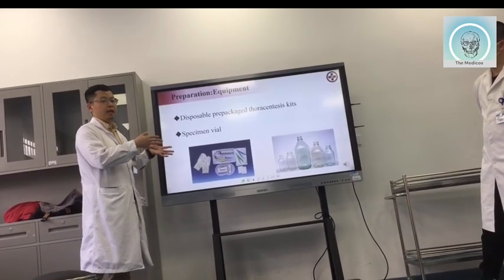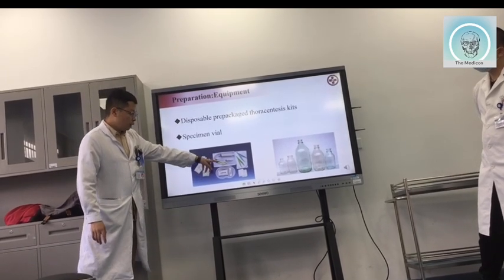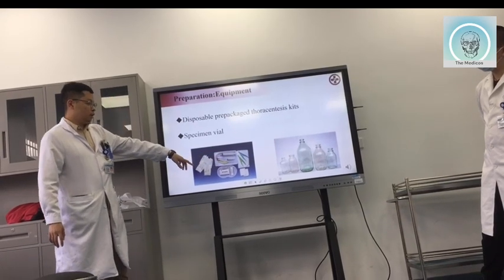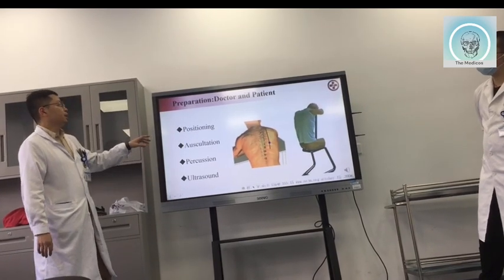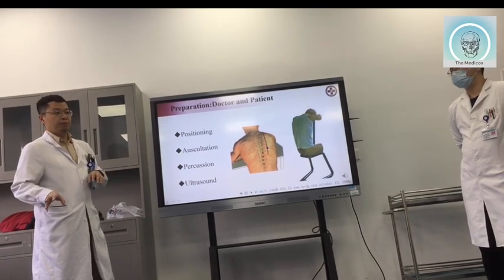But we should prepare this kind of set. We have the gloves, we have the syringe, we have this forceps, and something else. Okay, so this whole package. And here we have the preparation. You should prepare yourself and prepare the patient.